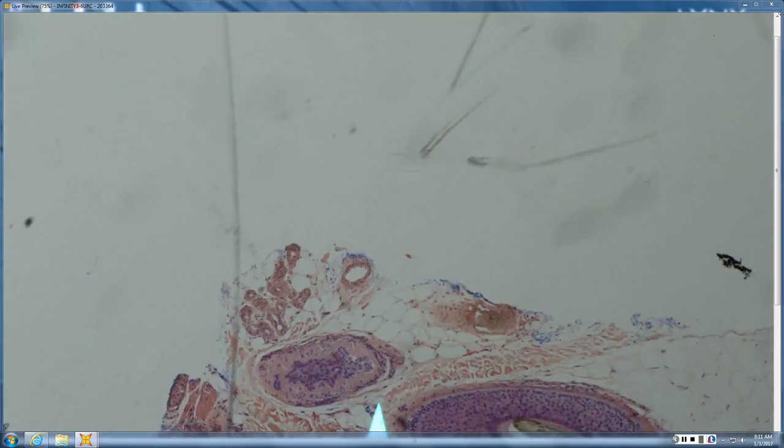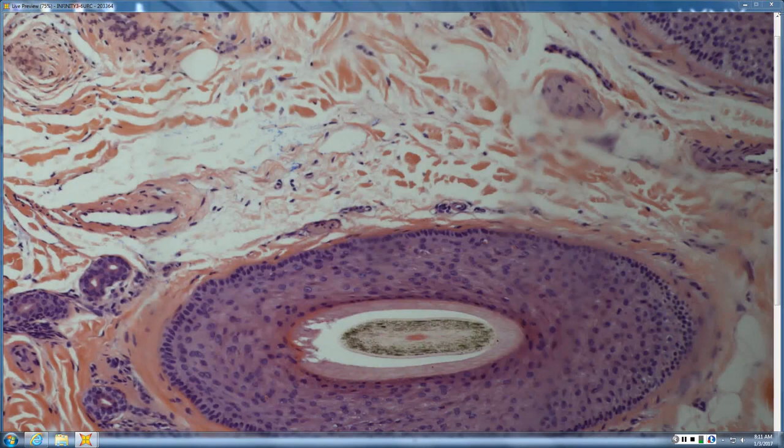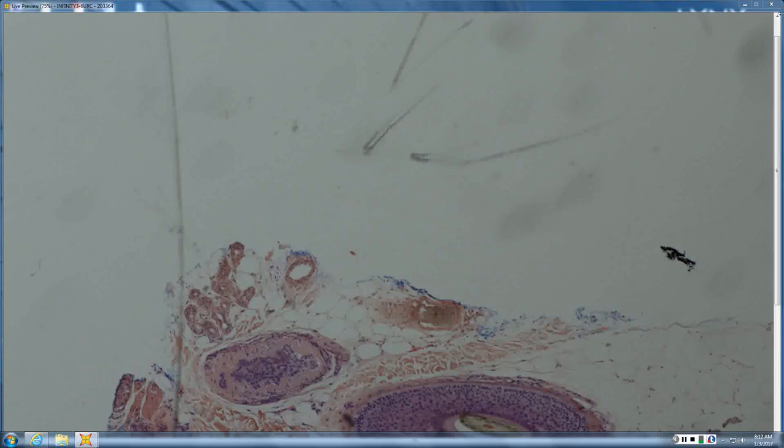And what kind of hair do we have there? A little catagen hair. And this one, which looks at first glance like anagen, actually has lots and lots of dead red, so it's probably early catagen. Right, so multiple catagen hairs, miniaturization, pointing you towards alopecia areata or syphilis. Don't forget syphilis can look just like AA.